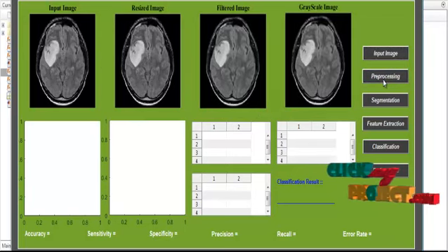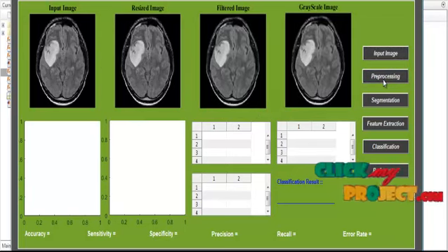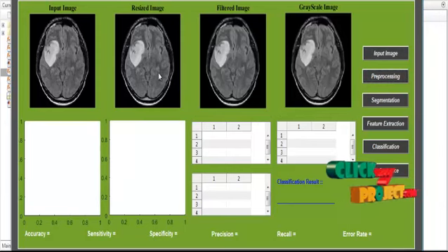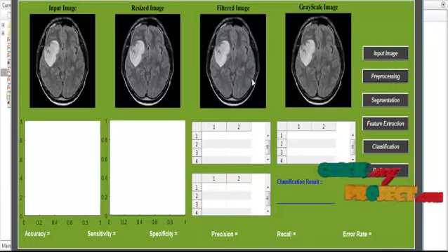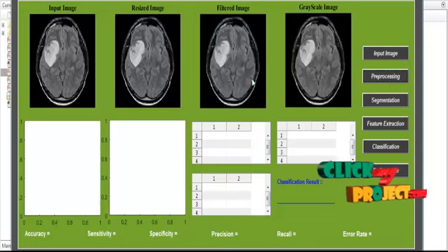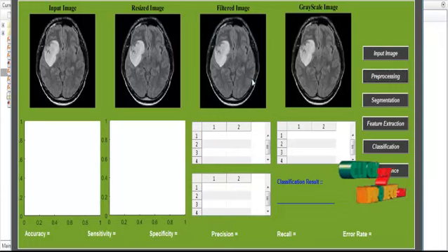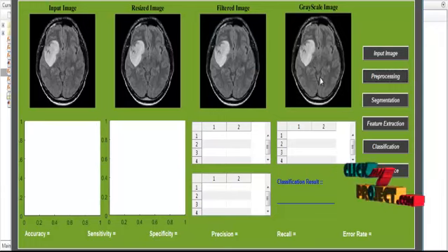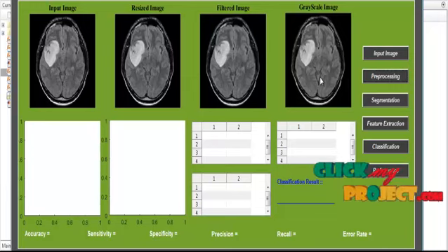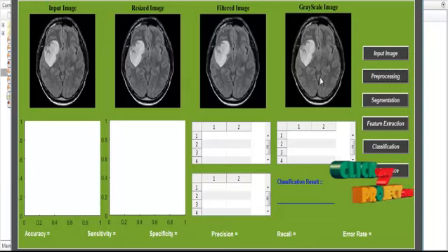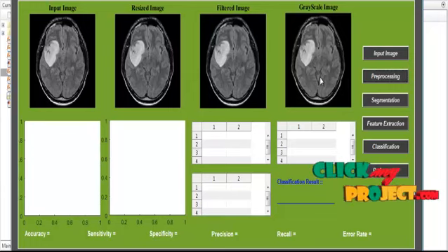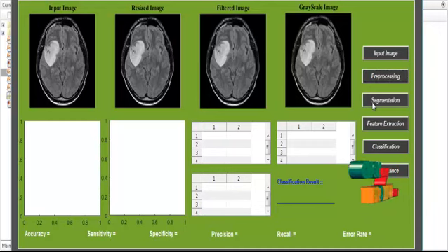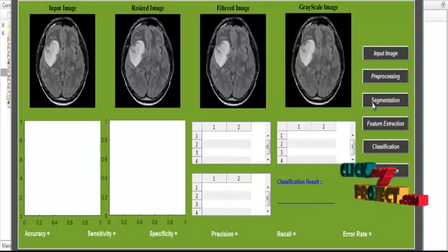In this preprocessing, as already discussed in the flow diagram, first the image will be resized to 256×256. After that, the median filter is applied to remove the noises. If noise is present in the image, it will be removed. Then grayscale conversion is applied to segment the region — the initial step of segmentation — and it is also done in preprocessing. After preprocessing, we move to segmentation.